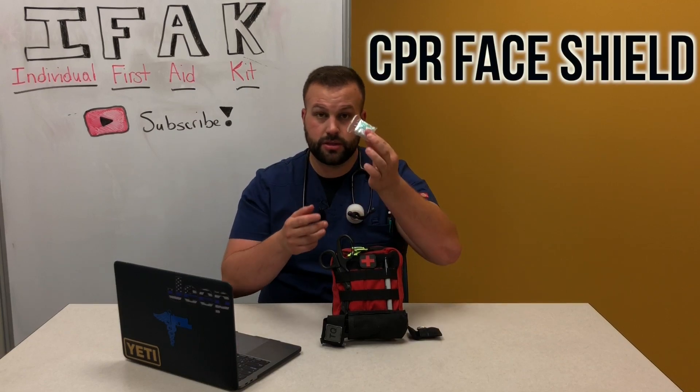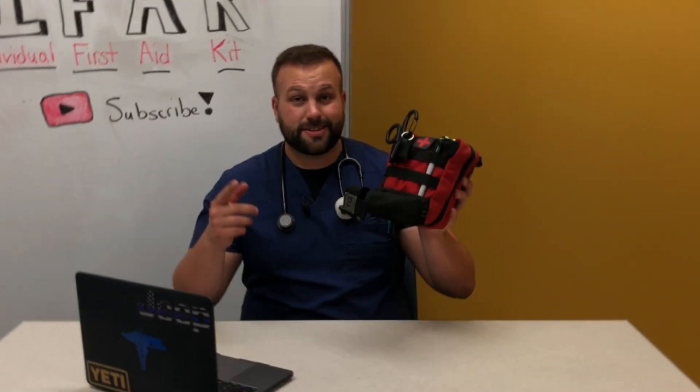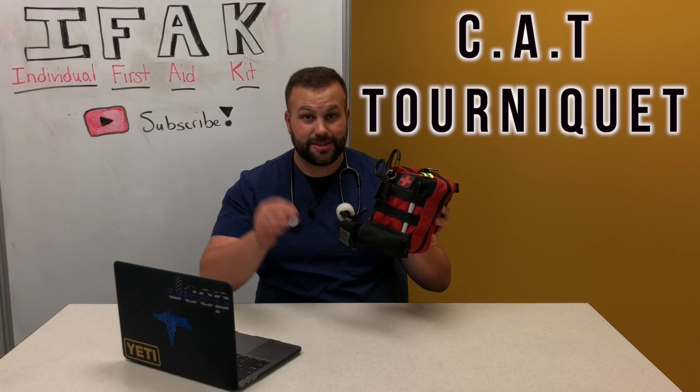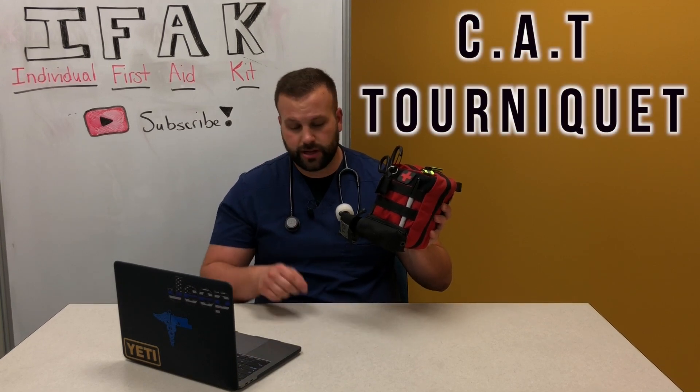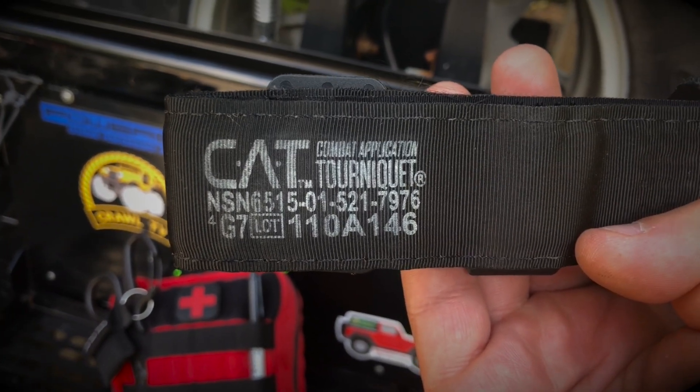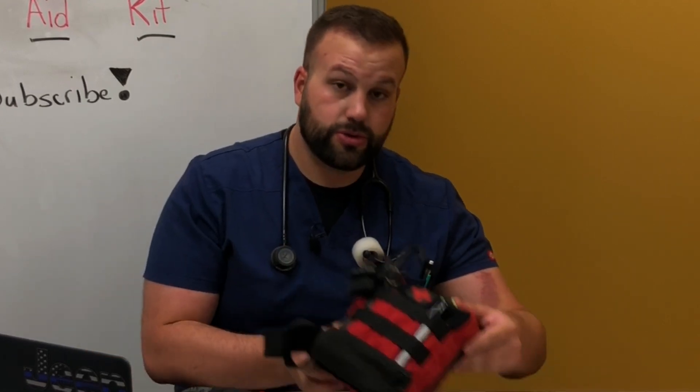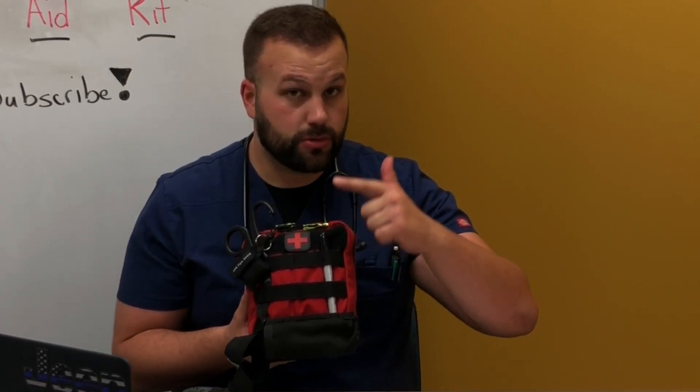Next up is probably one of the most important pieces of this kit: the CAT tourniquet — the Combat Application Tourniquet. This one is from North American Rescue. After applying it you have to mark the time, so you should keep a Sharpie or marker of some sort handy. I'm not going to show you how to apply it here because that's a whole different video I'm creating soon as part of my Stop the Bleed series.